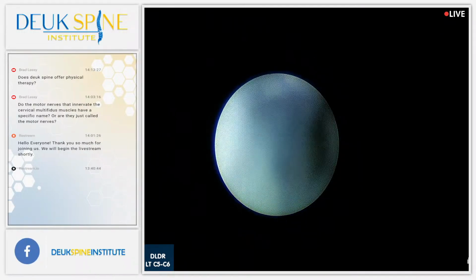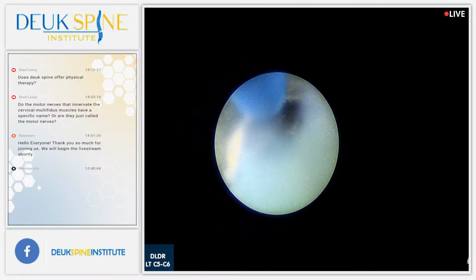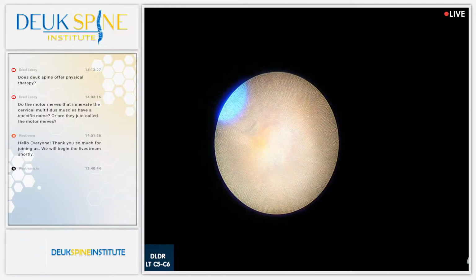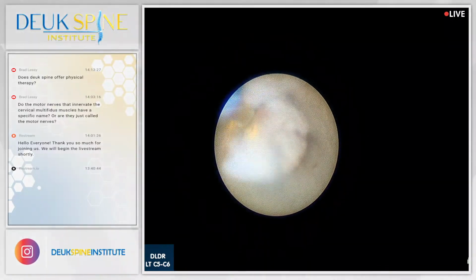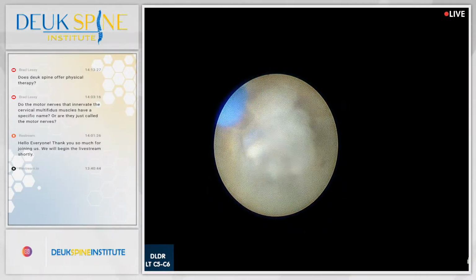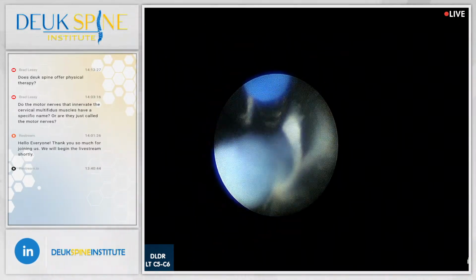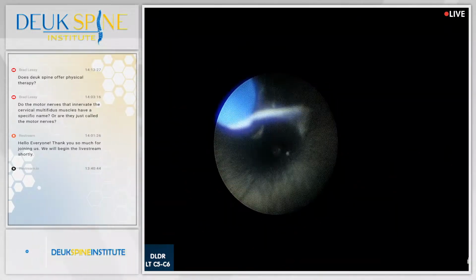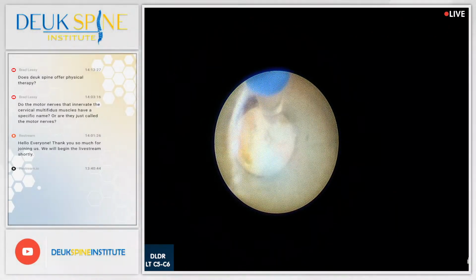Look at that herniation right there, guys. I don't want to mess around with the scope, okay? You either do it for me, or we just keep going. It's a bit over bright. I need to bring the brightness down. These are all pieces of herniation, folks, coming out. See the blue things? Yes, we do. Those are herniations.